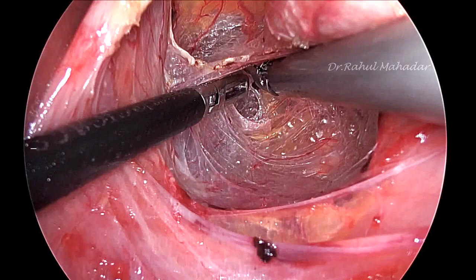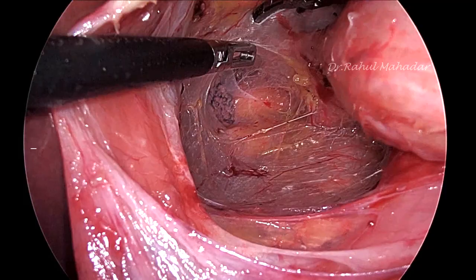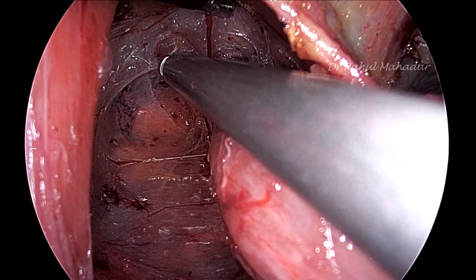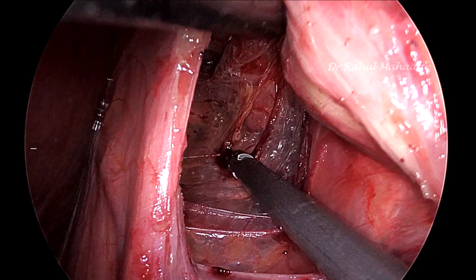Here, while doing this dissection, there is a high chance that you can injure the pleura. So you have to be very cautious. You have to identify the structures properly. So for identifying structures, as far as possible, you have to avoid bleeding in this area. So small bites of harmonic, and you can dissect it. And posteriorly you can see the aorta.